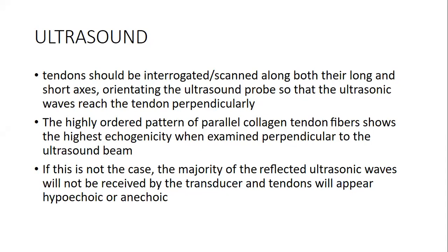echogenicity. And if your echogenicity changes, you are likely to see pathology where there probably is no pathology because of the angle that your beam will strike the tendon. So you have to scan at a perpendicular direction to the tendon.